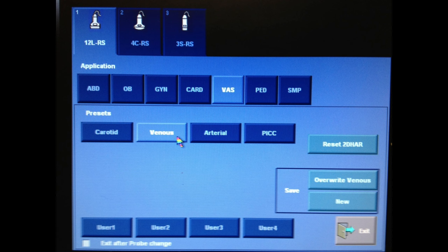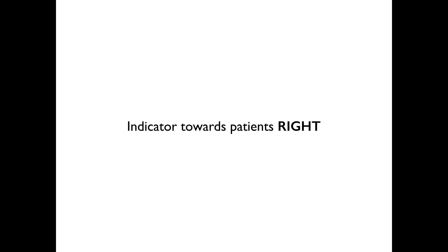Like with all our other applications, you want to make sure you select the correct presets. Every machine is a little bit different — you can just choose the venous setting. The indicator on the transducer is always going to be towards the patient's right side in order to orient yourself.